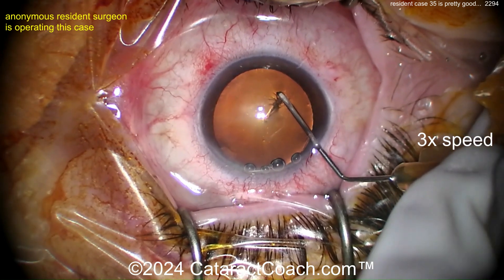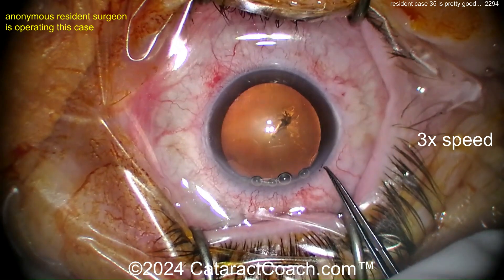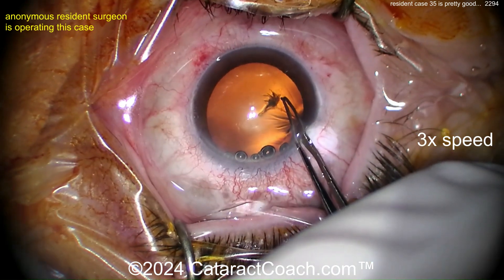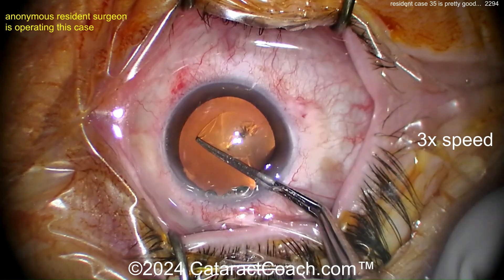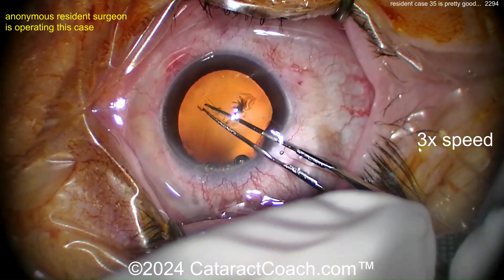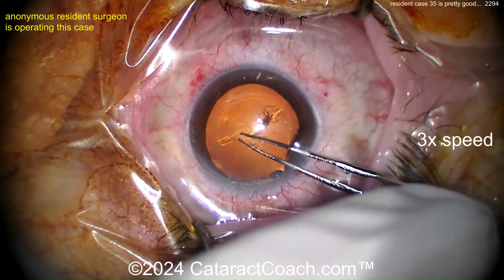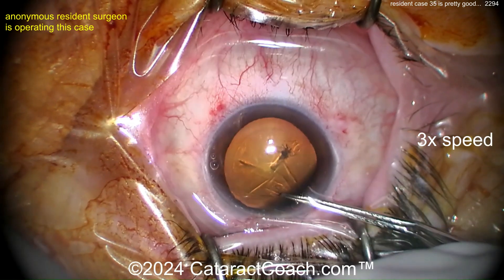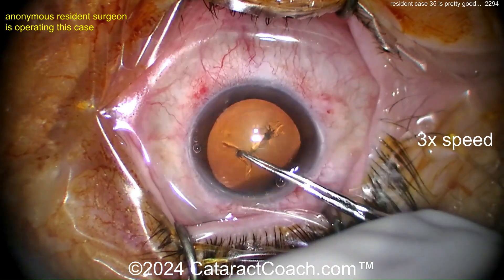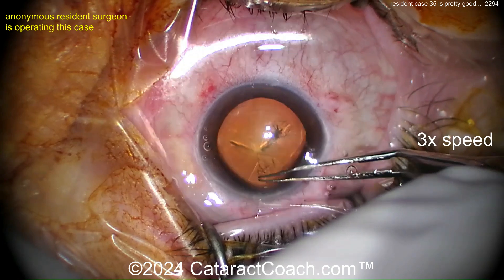The draping — the upper lid, which is the bottom of your screen, is draped nicely; the lower lid is not. Try your best — maybe don't crank the speculum quite as much. You know where you can find great videos about how to do beautiful draping? cataractcoach.com. Go to the website, not just YouTube — go to the website and check it out and you will learn a lot and you'll be better at doing the drapes.